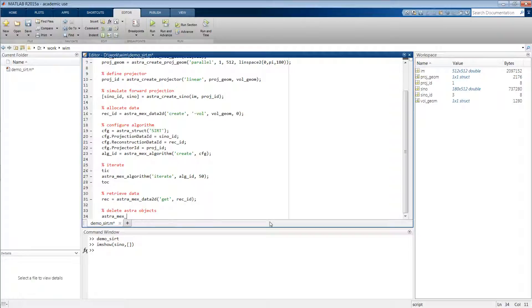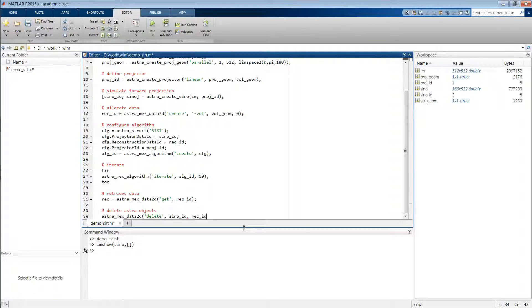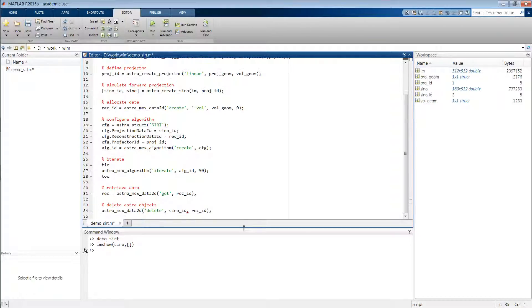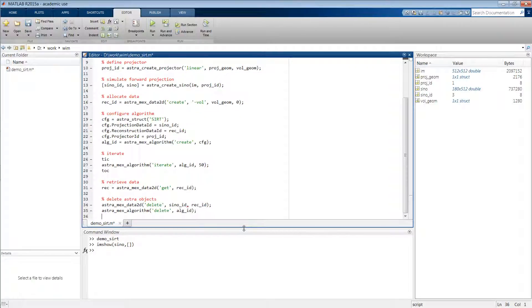For example, we can say astra_mex_data2d, and then delete the sinogram object and also the reconstruction object. The same then goes for the algorithm, so delete the identifier of our SIRT algorithm, and then finally also for the projector.